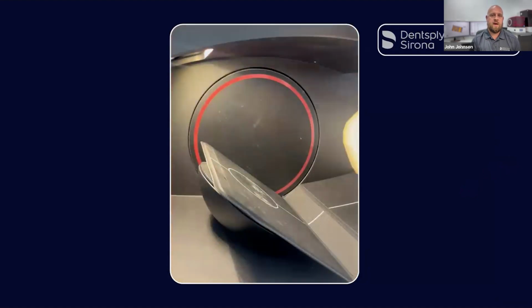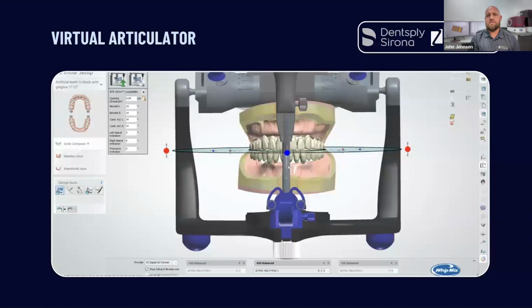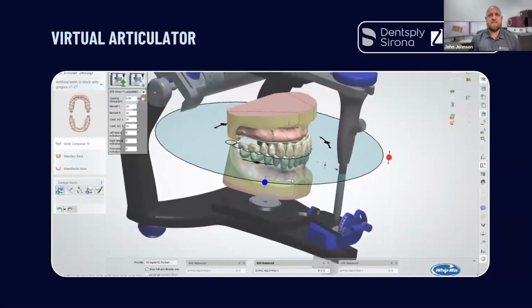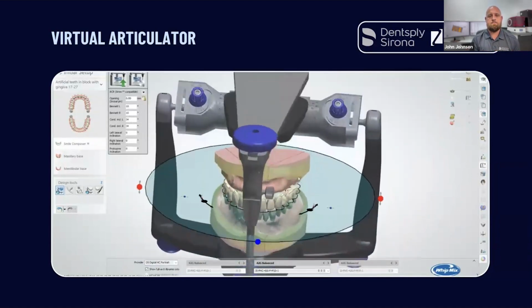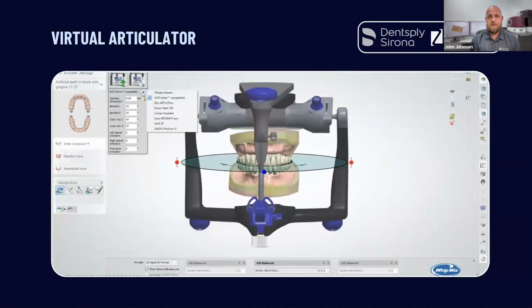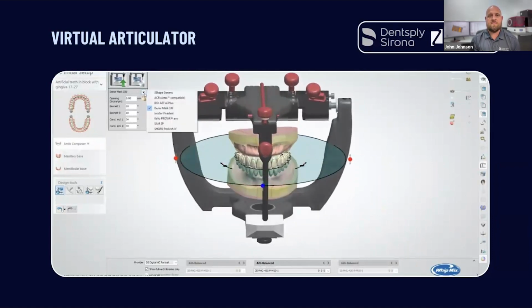And then once you get past that, they'll run you through, and then you do all of your alignment steps. And you can be sure that you aligned those properly based on how you were holding them together. So for me, when I first got into this, the virtual articulation, again, it's something that you're leery of. It's a little bit of a leap. But I've now got close to 3 years under my belt of producing dentures this way, with not a single doctor having come back and said, hey, the bite is extremely off, outside of typical try-ins and all those other instances.